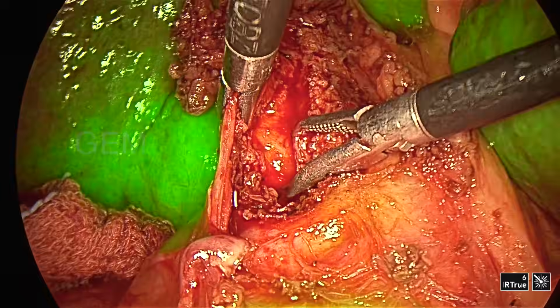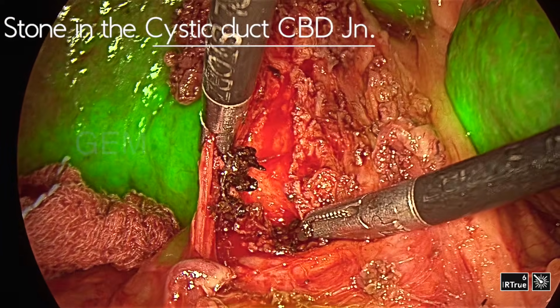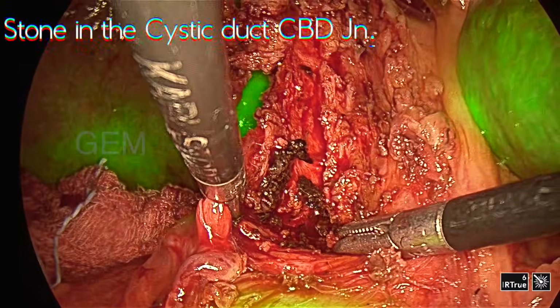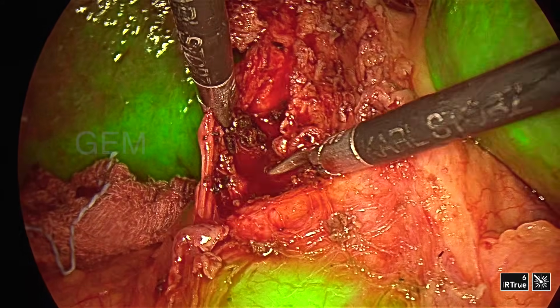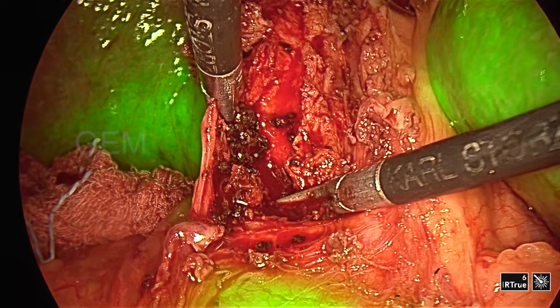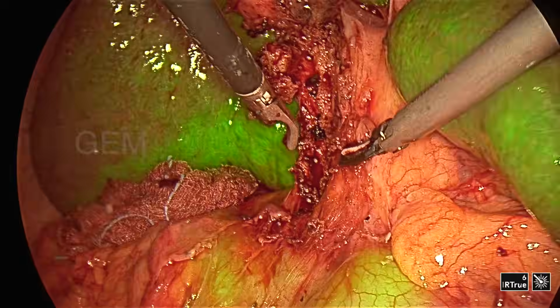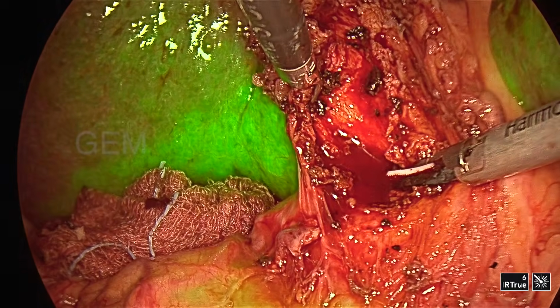So I am trying to remove the stone. That is the stone in the cystic duct CBD junction. So it got broken. Even if it is broken, it's no problem, you can remove it fully. A little difficult access case, very low insertion of the cystic duct to the CBD.